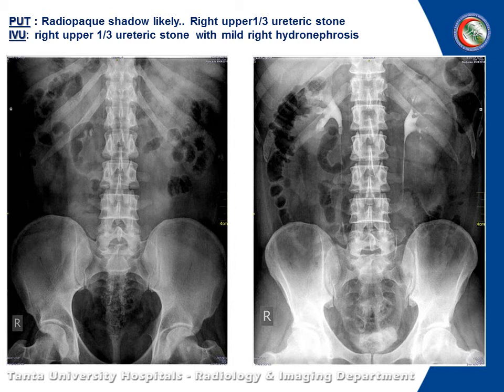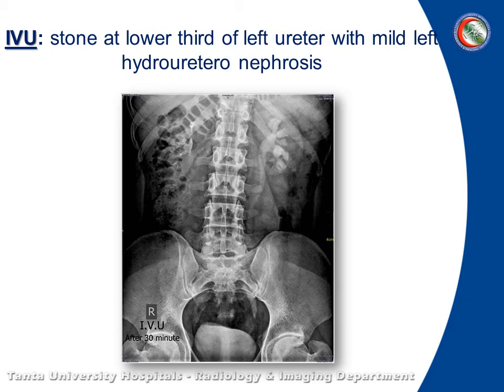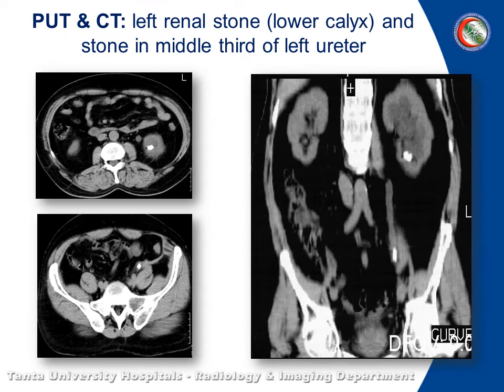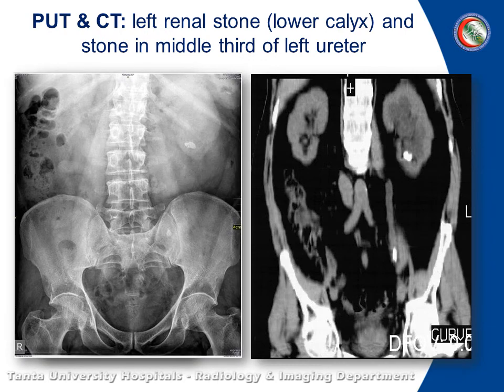Here on plain X-ray you can see a right upper third ureteric stone, and on IVU there is a filling defect in the upper third or proximal ureter. Stone in the lower third of the left ureter with mild left hydronephrosis. This picture shows a stone on CT. Lower calyceal stone as seen on plain X-ray and CT. And there is a middle third left ureteric stone.